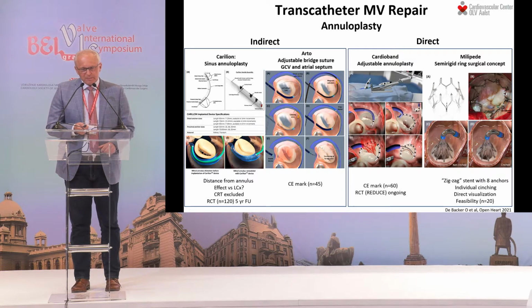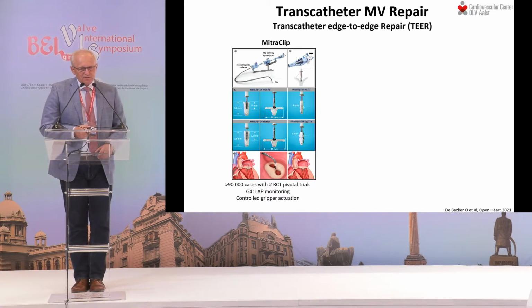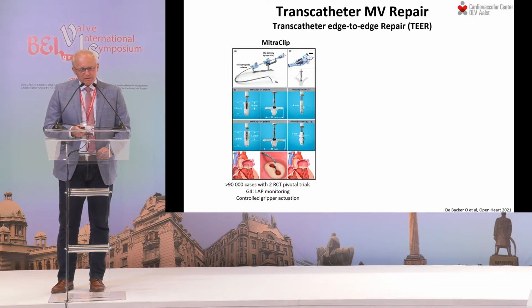This is for annuloplasty, and then we are moving to something more established, where we have more experience, and we are talking about leaflet therapy, transcatheter edge-to-edge repair. We all know MitraClip started in 2003.